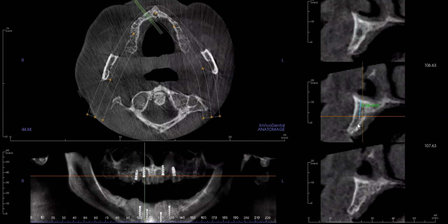We should talk a little bit about when we actually need to cut bone, not because of implants, but because of prosthetic space requirements. That will come out of the prosthetic workup later on in the case.